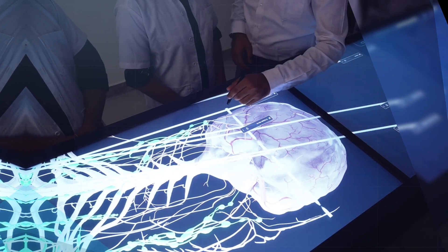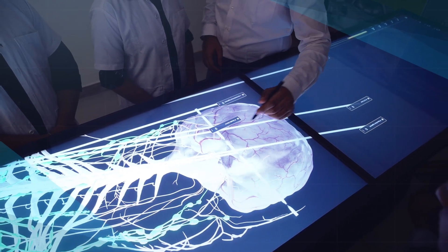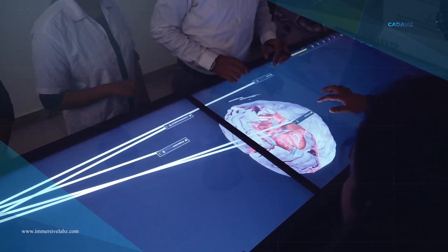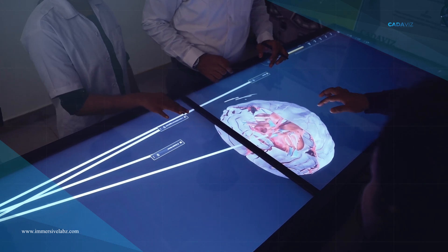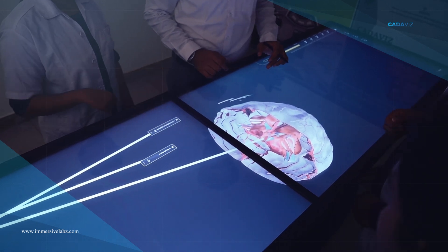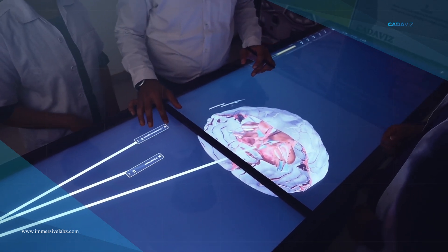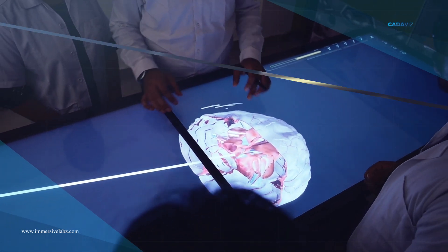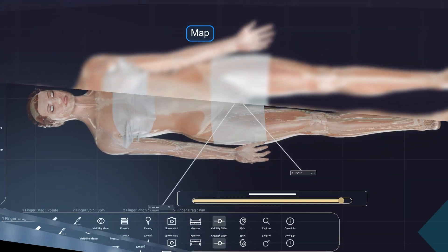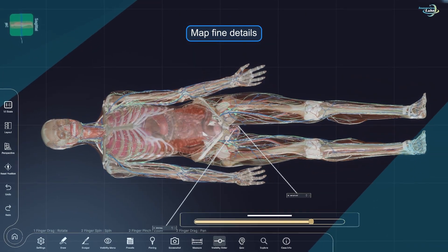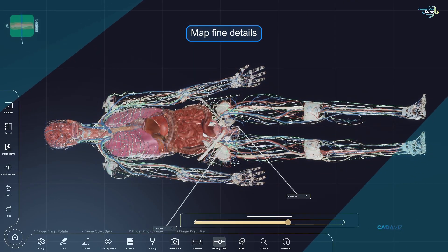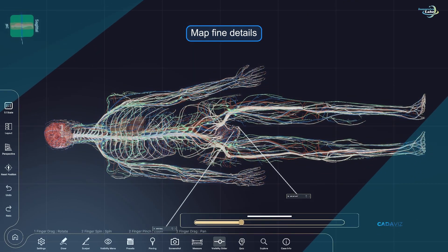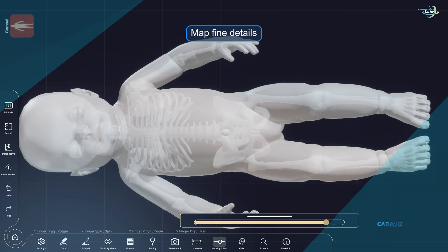Use a finger as a scalpel to execute dissection in any direction, at any depth, and disclose anatomical features. Create a model of the human body, mapping all blood arteries, nerves, and their connections.